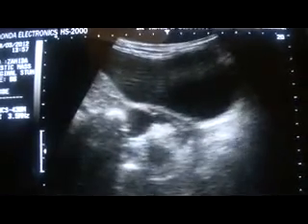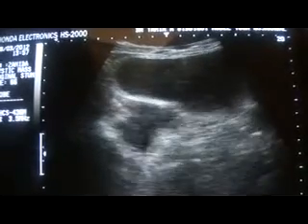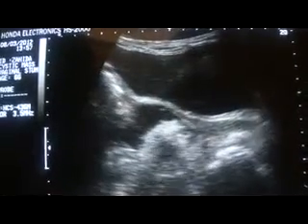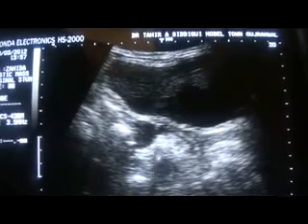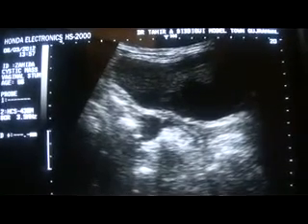Let me magnify it further — it will become more clear. Now you see there are fine echoes; it is not as black as it should be. This is the urinary bladder and you can see it is black. If this fluid had been without echoes it would have been black like the urine in the urinary bladder, whereas you see that the fluid is filled with low-level internal echoes.